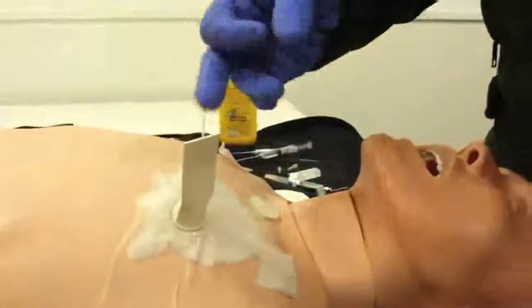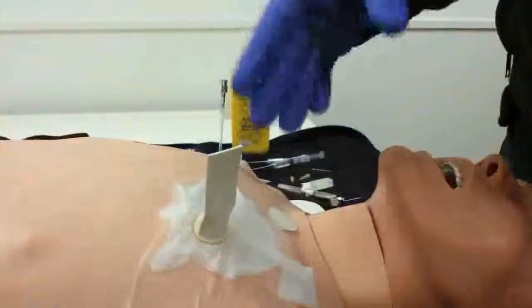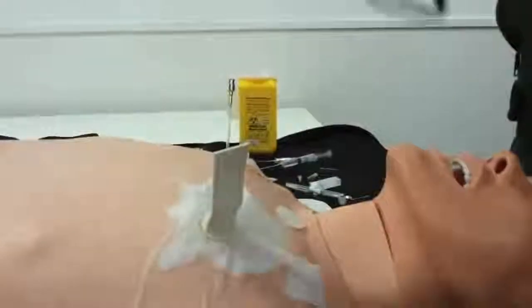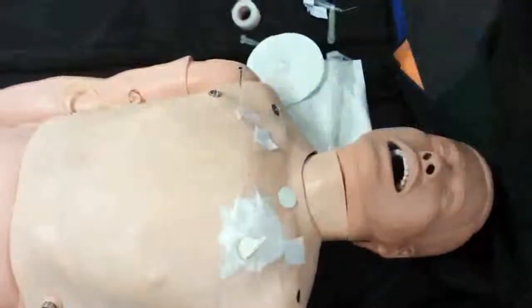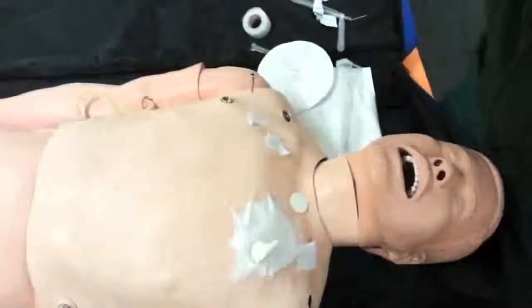What we're looking for is the valve opening and closing to show that air is getting out but no air is getting in. Then what we hope to see is an improvement in the patient's clinical condition and comfort. It may take some time, but you want to auscultate the chest looking for nice equal air entry.